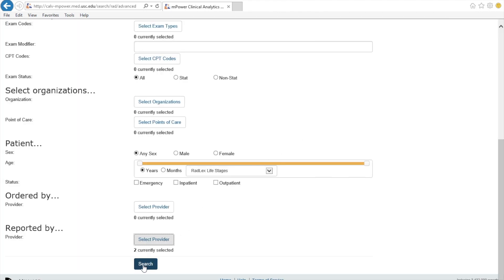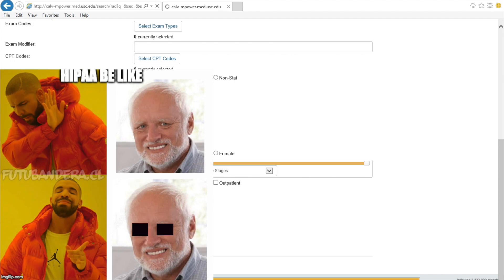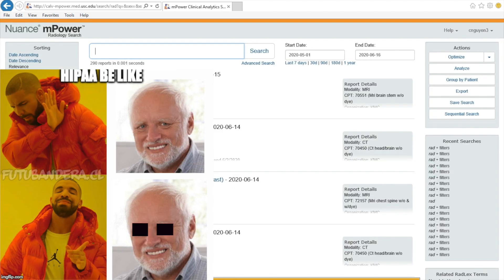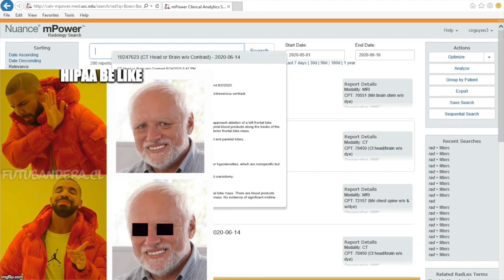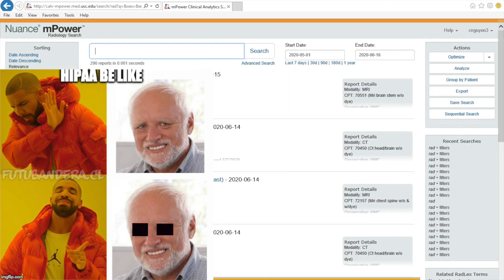Then I'm going to go ahead and search. And here you go — mPower has pulled up 290 reports that were read by the two radiologists we specified within those dates.